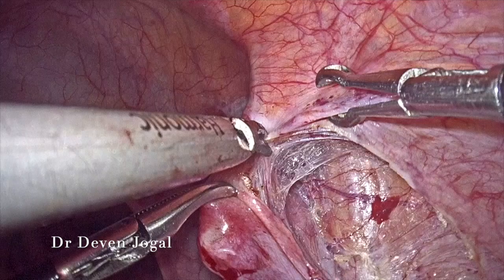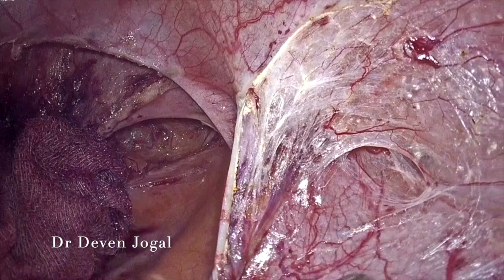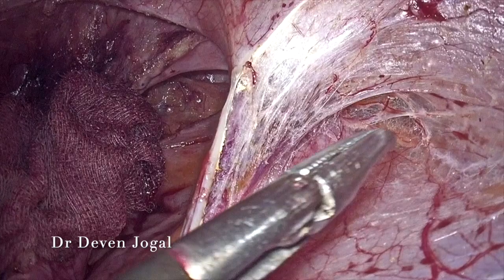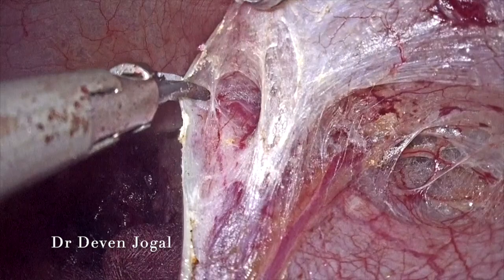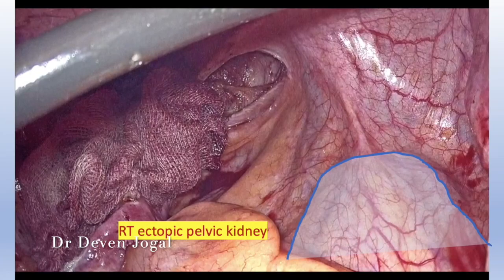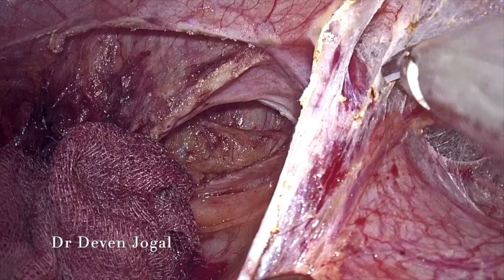On the right side, the dissection was a bit difficult as the patient had a right pelvic ectopic kidney, so we were very slow. Millimeter by millimeter dissection was carried out; each and every fold was thoroughly scrutinized as we were not aware of the course of the ureter and the course of the renal artery and vein. You can see the bulge of the right ectopic pelvic kidney and the lowermost fold, which most likely corresponds to the fold of the bladder — this is the point where we were expecting the ureter to be.